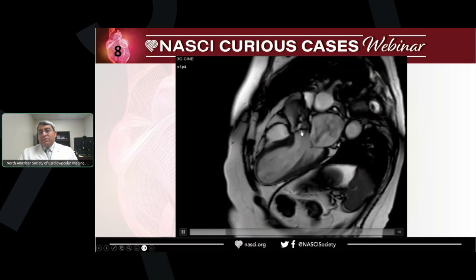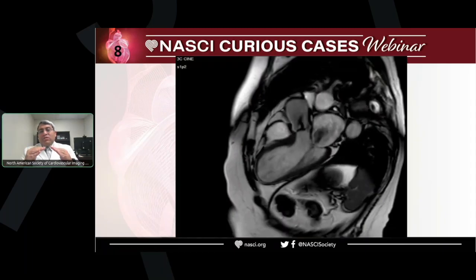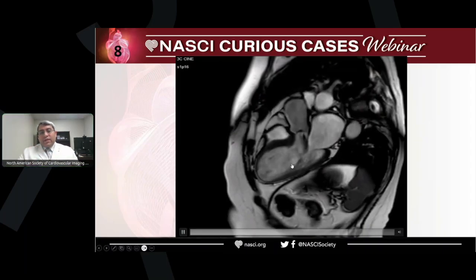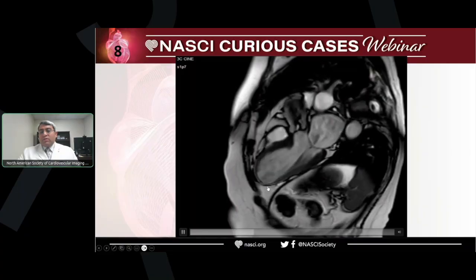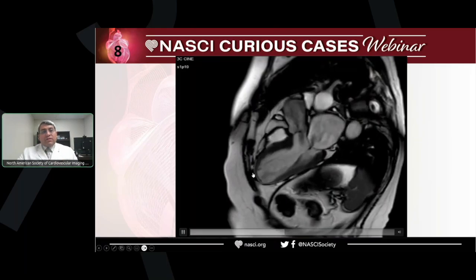You see barely aortic valve movements. The aortic valve is thickened and barely moves. So it is more or less a little bit open and not closing or opening. It is just like this. So there is regurgitation and stenosis in the same valve. And you see this patient also has marked thinning out of the left ventricular wall. So probably all this is a result of prior ischemic heart disease as well.